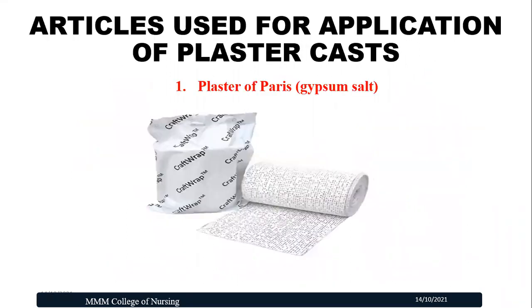Next, we look into the articles that are required for application of the plaster cast. The first article or material that is required is the plaster of Paris or gypsum salt. Plaster of Paris is soft and malleable when moistened with water, but it becomes very hard and durable after drying.